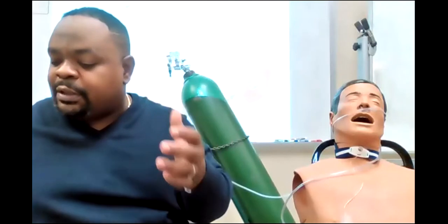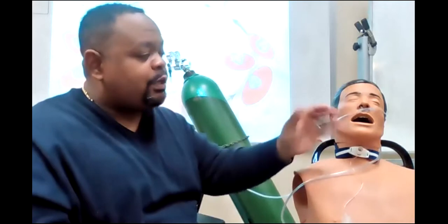So when somebody's oxygen is a little low and they're calm, you want to give them a little oxygen, then you can start with a nasal cannula. But we only want to give them enough to stop hypoxia, right? You don't have to jump straight to life support. I don't want to stick a tube down his throat just because his oxygen was a little low, right? Start low. You only want to give enough oxygen to stop hypoxemia, okay? So if you got him on 4 liters and you look at his sat and he's 96%, then stop. That's enough. If you got him on 4 liters and his oxygen is still 89%, then we need to go up a little higher, up to about 6 when we're dealing with the nasal cannula, right?